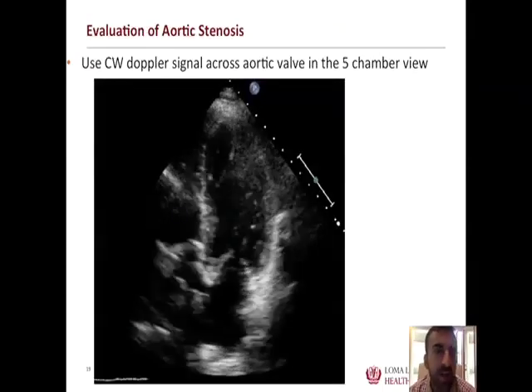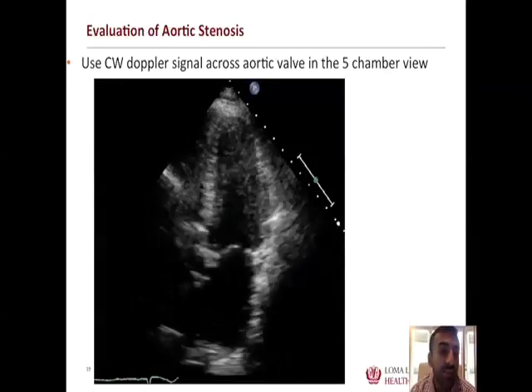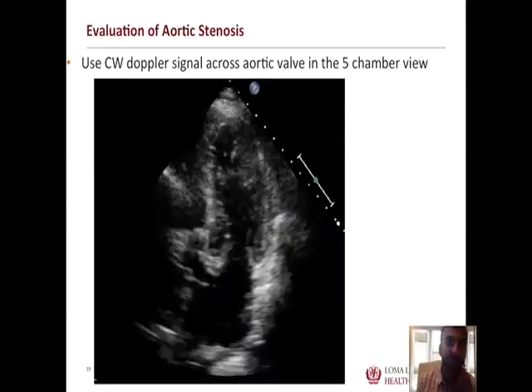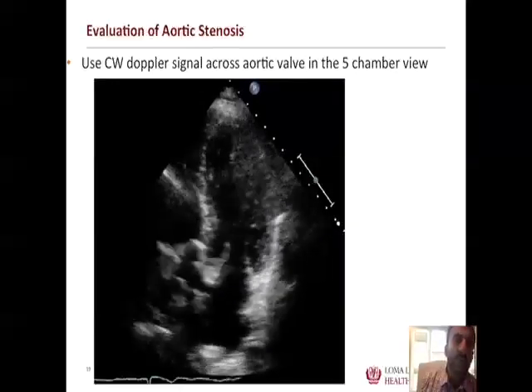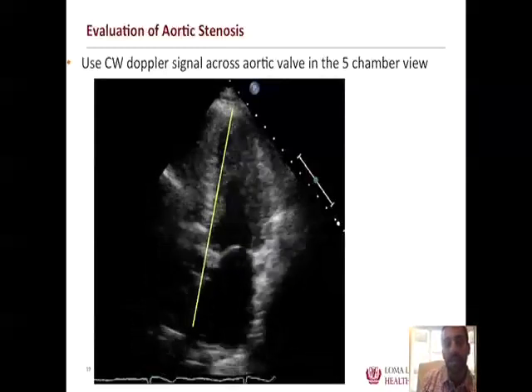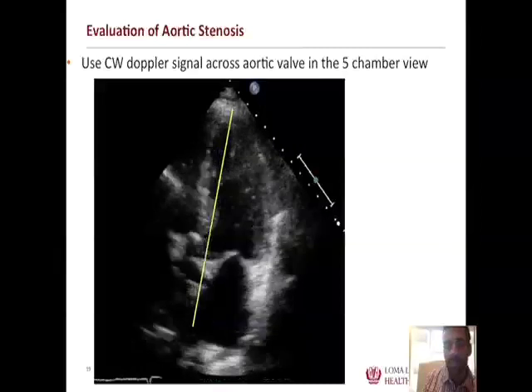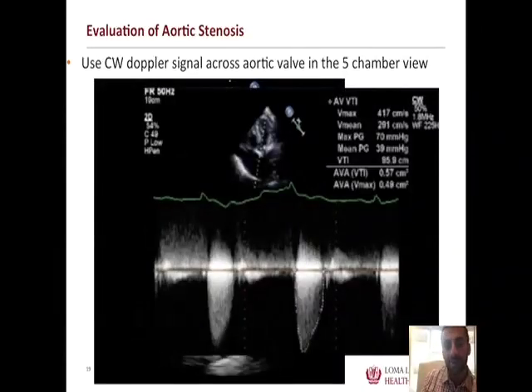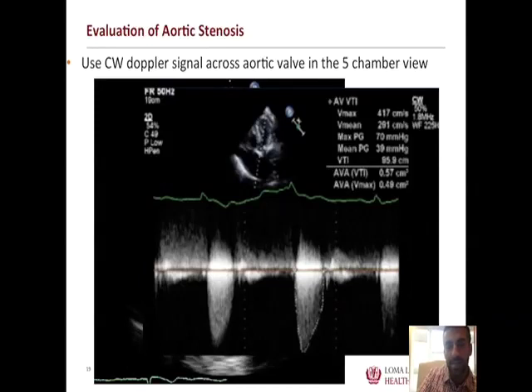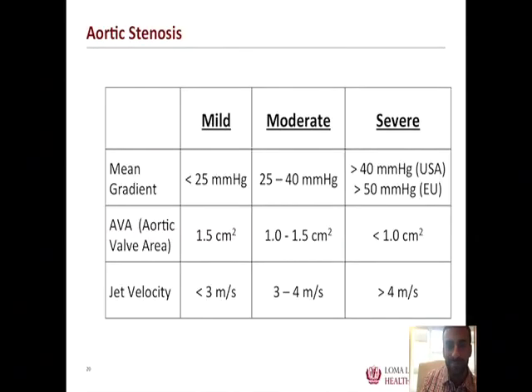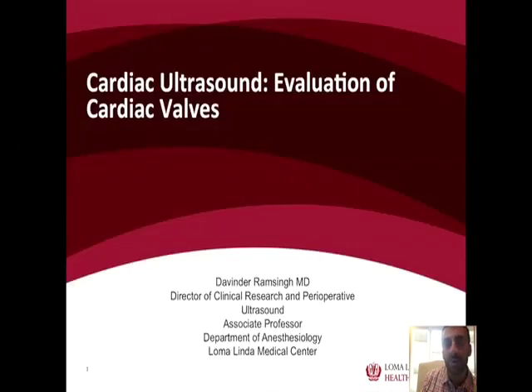Finally, for evaluation of potential aortic stenosis or any valve stenosis: get your 2D picture, then align the continuous wave Doppler — represented by a yellow line across the aortic valve — engage it, evaluate flow acceleration, and get your measurements and gradient calculations. A reference table allows you to designate the severity of that stenosis, completing the utility of point-of-care ultrasound for the evaluation of cardiac valves.